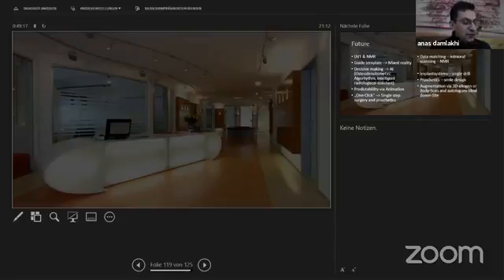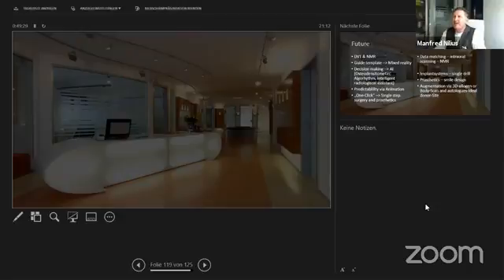how do you decide which implant system you will use in any case? Well, first of all, I ask the patient. When you see a new patient and he has no implant, I decide what the best implant is for him. We have almost 20 different boxes in our office, including zirconia implants and titanium implants. So I ask the patient.